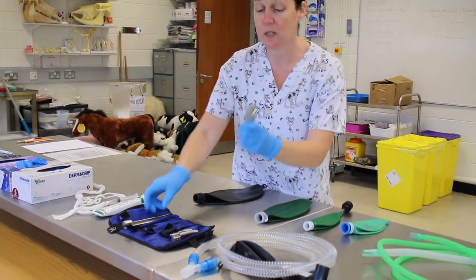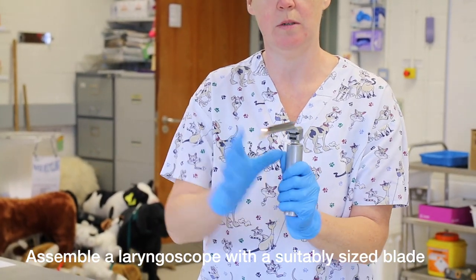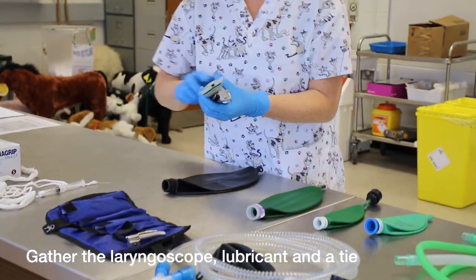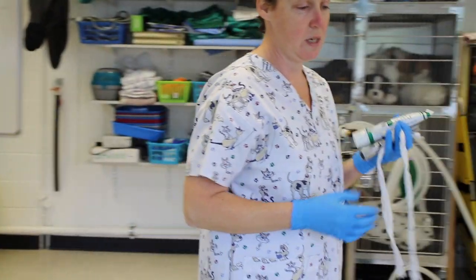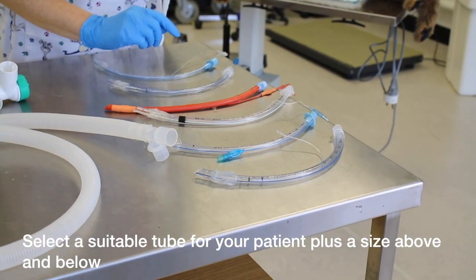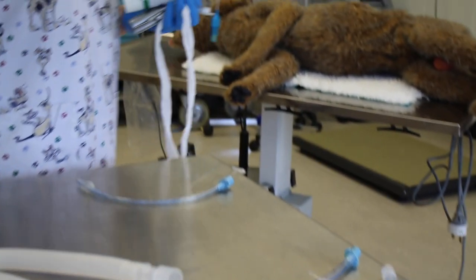We attach our laryngoscope, put it on at an angle, flick up and make sure your bulb is working. We're going to bring our lube, our syringe and our tie to secure our tube in place. Then we're going to select three suitable tubes — the one we think is the right size and one above and one below. So I'm going to go for a seven, a six and a half, and a seven and a half.